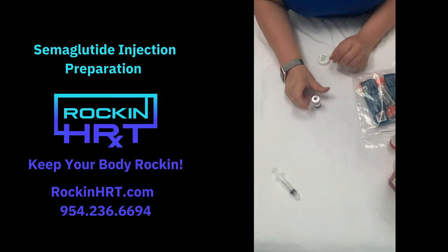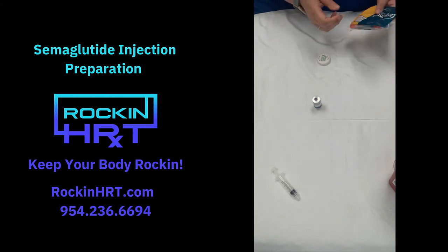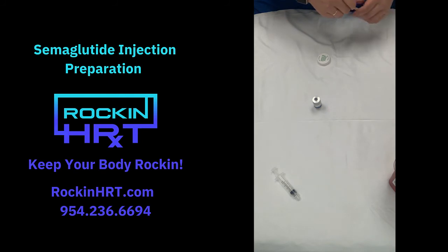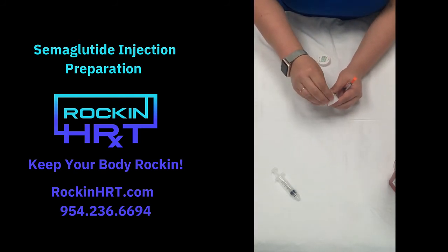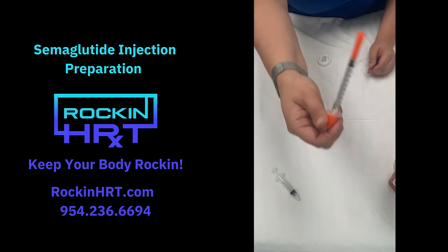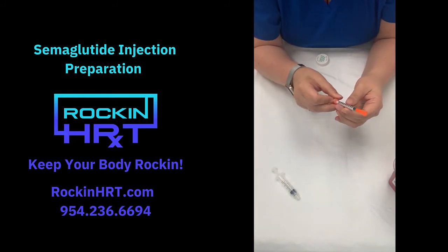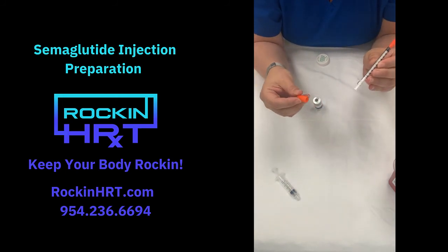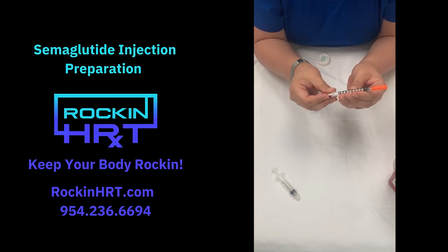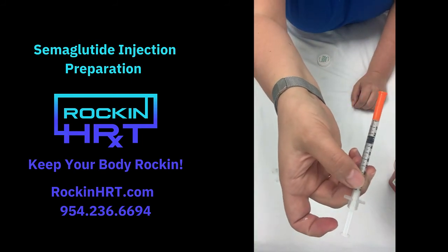Once that's done, depending on your dosage — most people are starting off at 0.25 unless the doctor tells you something different — go ahead and wipe off the top again. Now you're going to grab one of your insulin-sized needles. We are going to draw to 0.25. Take the end off the plunger and prime it real quick because sometimes they stick a little bit. 0.25 is going to be right there, halfway between the 2 and the 3.